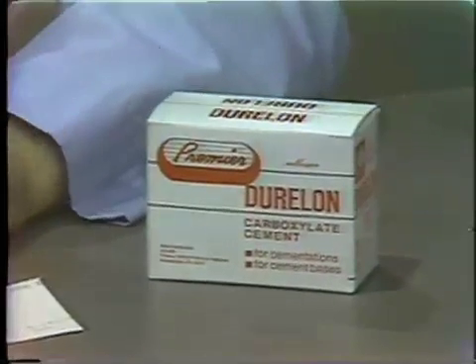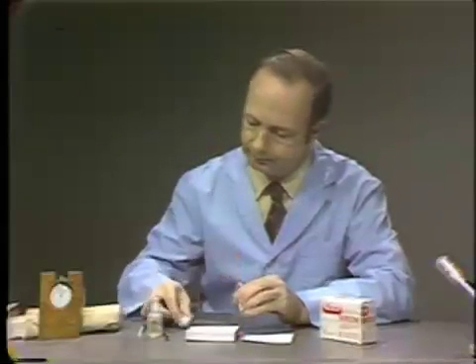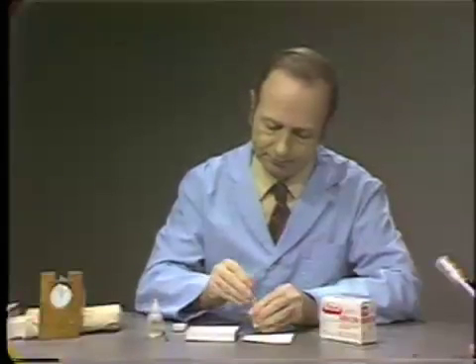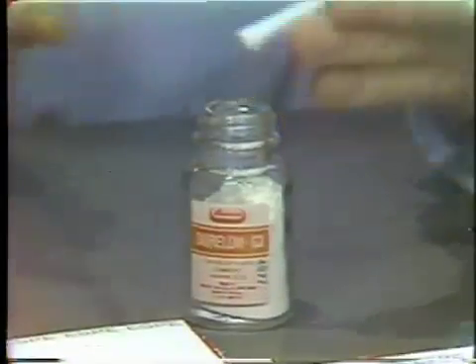The first step is to tap the bottle of powder against the desk to compact it. Then firmly press the powder dispenser into the powder, scrape off any excess material, and tap it sharply in order to dispense the powder onto the pad.